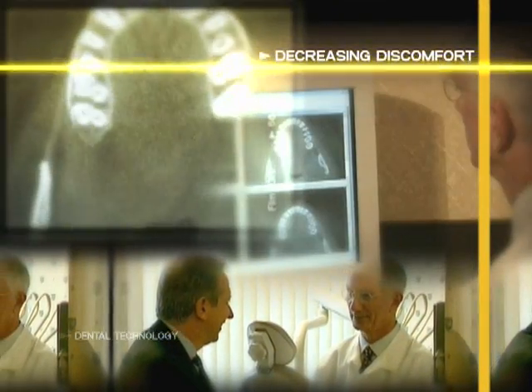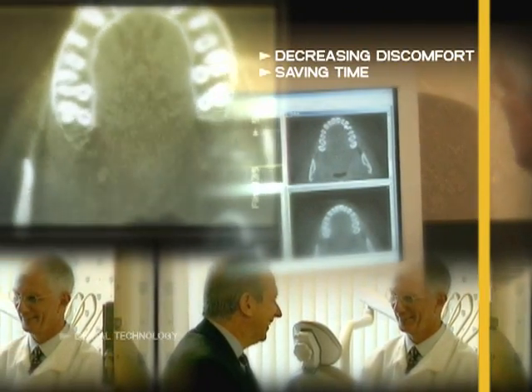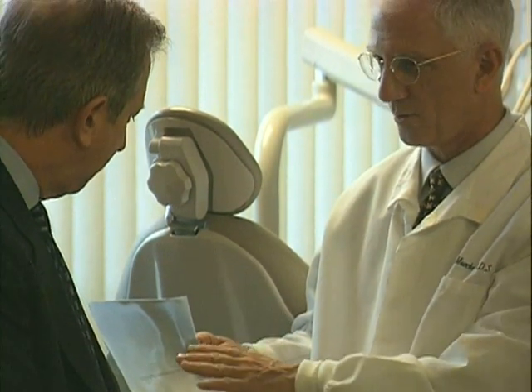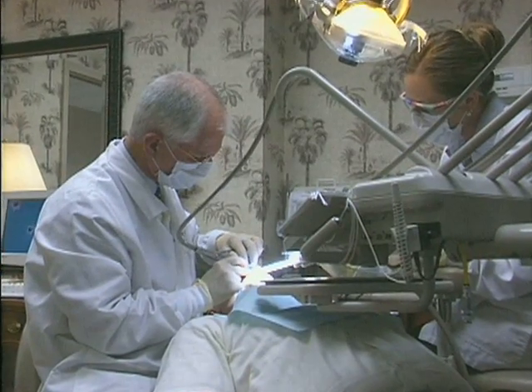Research is basically looking at providing precise measurements of a patient and moving that into a method that the dentist or doctor can use for their treatment planning, reconstructions, and overall patient care. The way things operate right now, there is no easy way for a measurement to be done of that individual patient. So if they get a crown, when they go in, the dentist spends a long time using that individual patient as the fitting for making that crown.